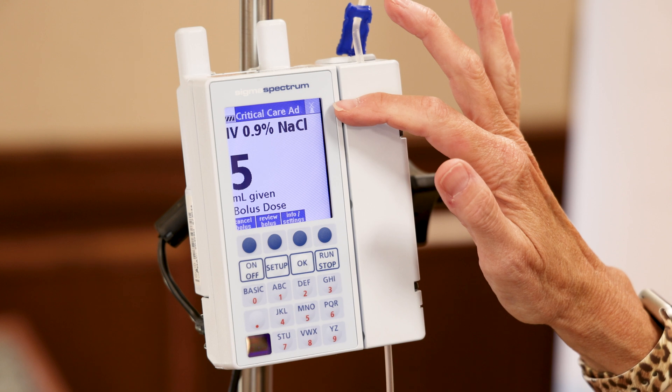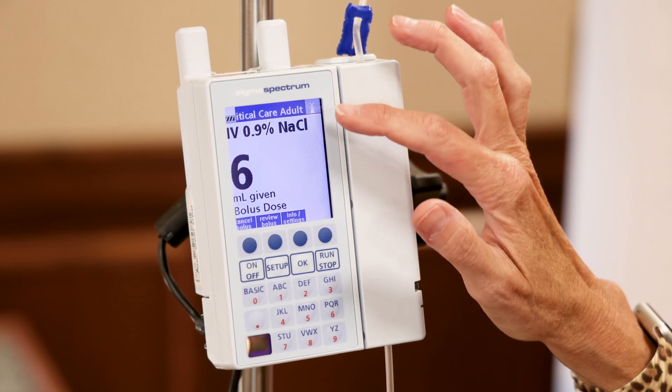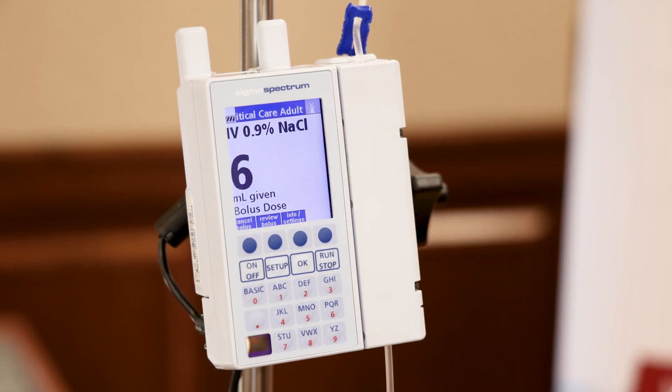On the top right, you see the icon for the wireless. It has an X right now because we're filming in a non-wireless environment. If you are in a wireless environment, the X will go away and this icon will turn green.